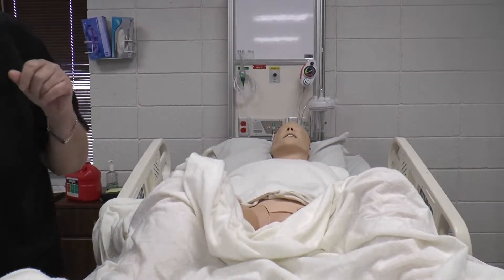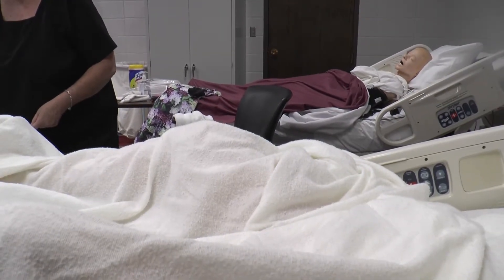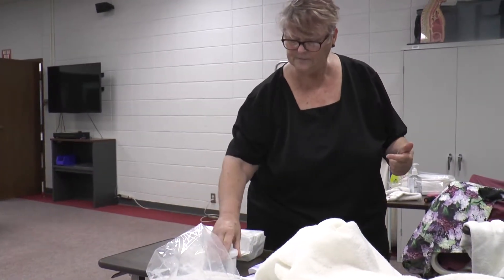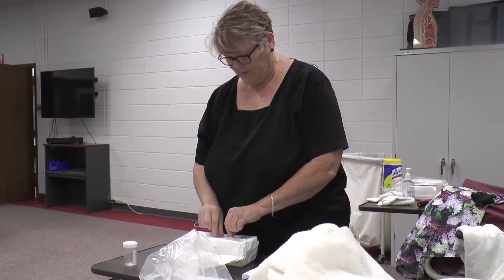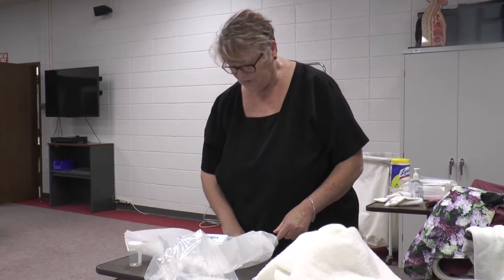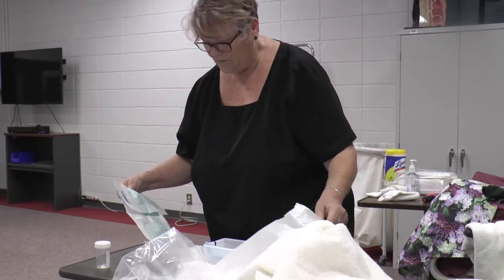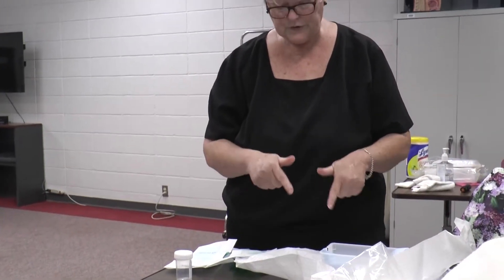Put on clean gloves, turn the tray around, and open it up. You never want to turn your back on your sterile field because that contaminates it. Going side to side is okay, but going across contaminates the field, so really watch how you handle your sterile field. Then open your sterile gloves.